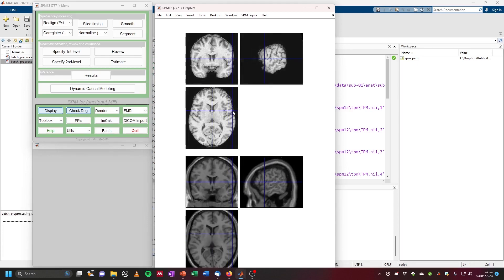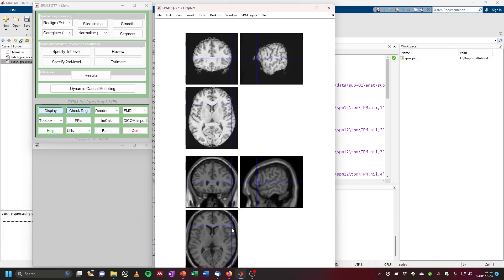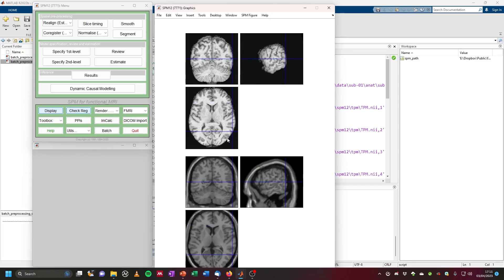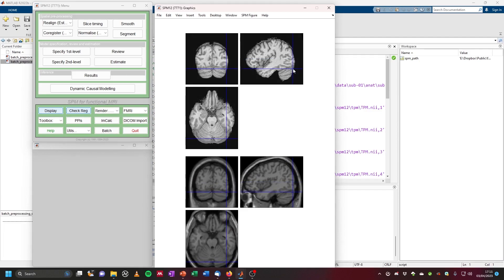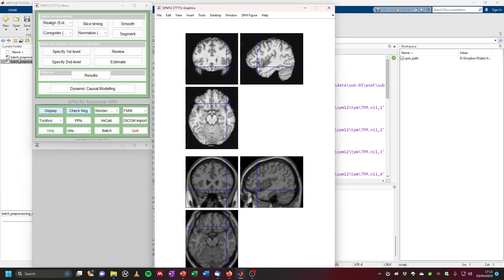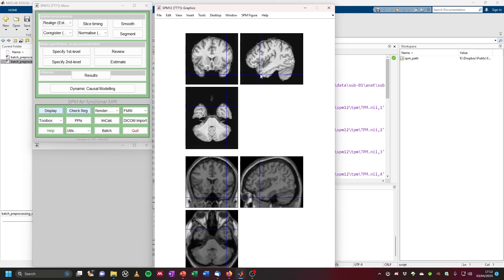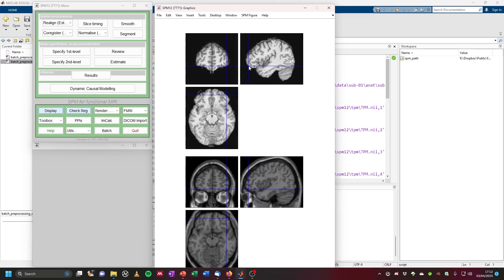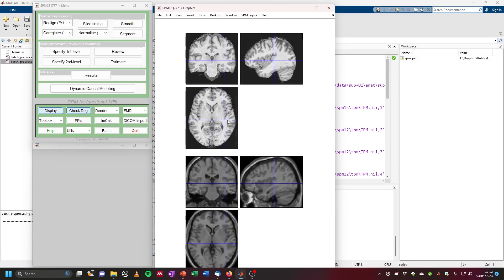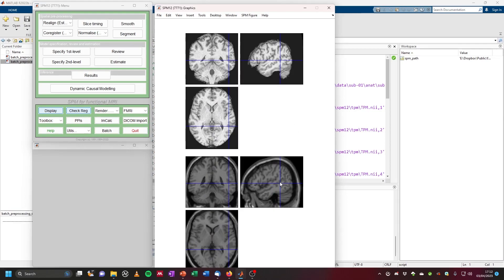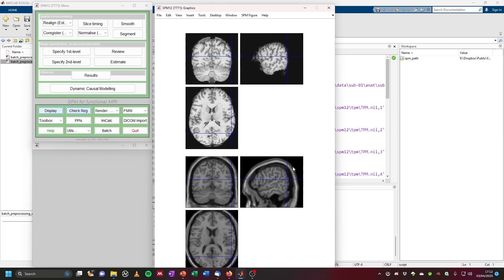What I would do is go to the edges and see if we're roughly at the edge of the template. There's a slight deviation, but overall it doesn't seem too bad. At the edge of the cerebellum, we're roughly in the same space in the template image. Same in the temporal pole or frontal pole. You can also go into sulci, for example the STS, and see if you're also in the STS in the template and not in a different sulcus or gyrus — which seems to be reasonably good here.